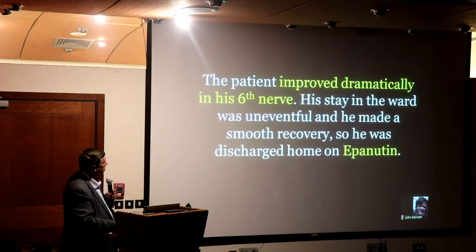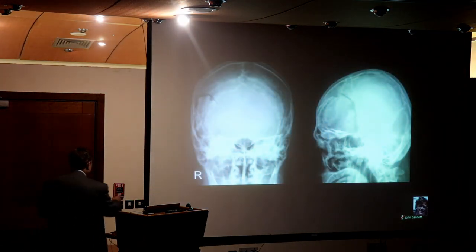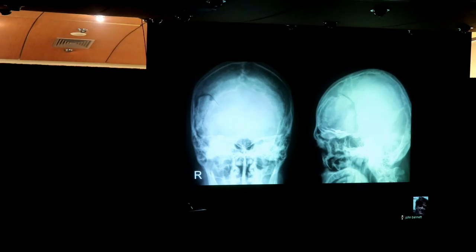Anyway, that's post op. Glasgow scale was well, and he improved dramatically. He was discharged. And this is the skull X-ray. Maybe I put the lights off for you to see the clip. You can see there and there.